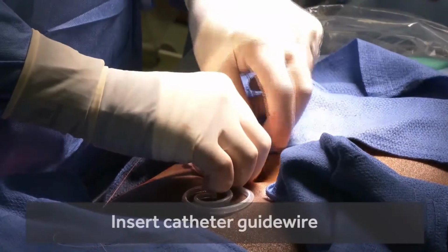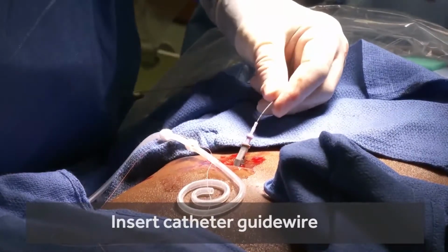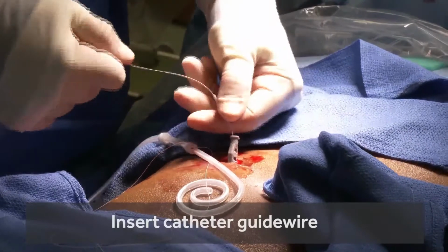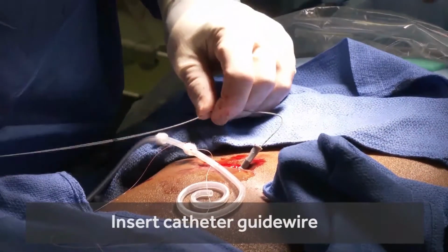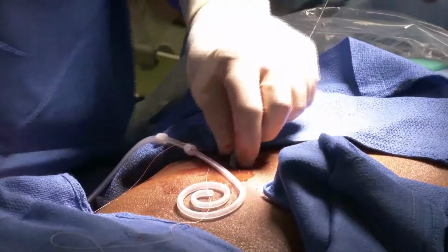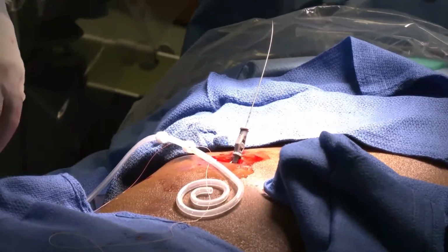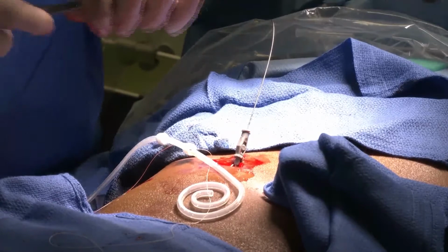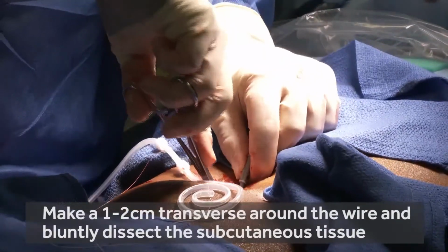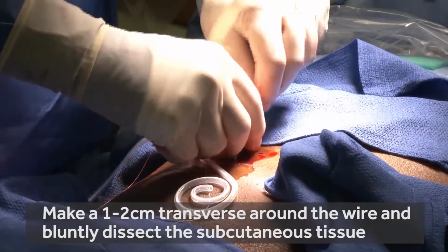Now an 035 guide wire is advanced through the micropuncture set. And again, under fluoroscopic control, we want to make sure that the wire is down into the deep pelvis. And we're going to widen the track because we will want that distal cuff to be in the rectus, beyond the rectus sheath.